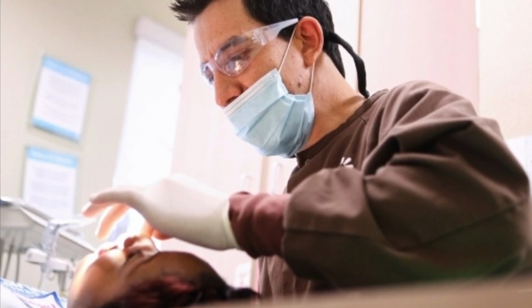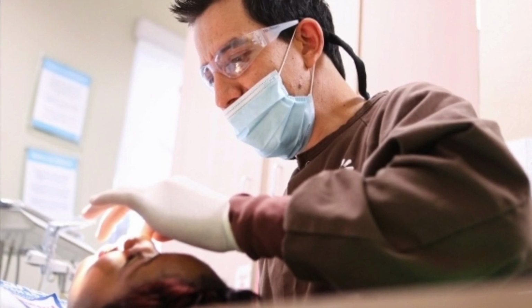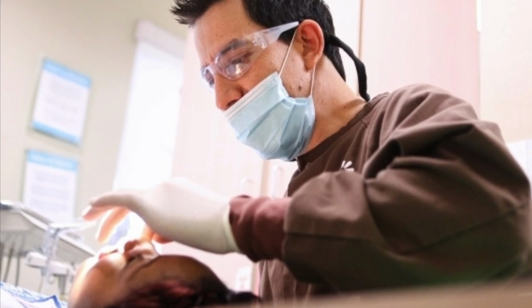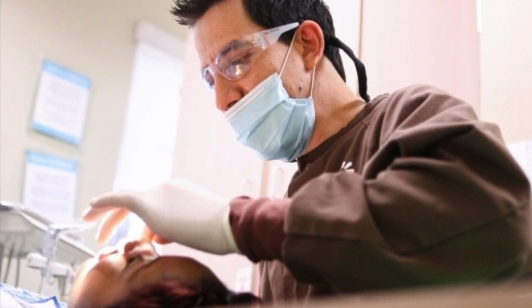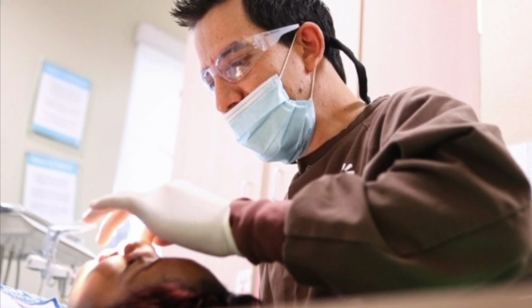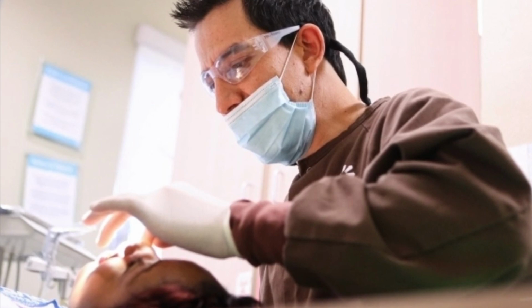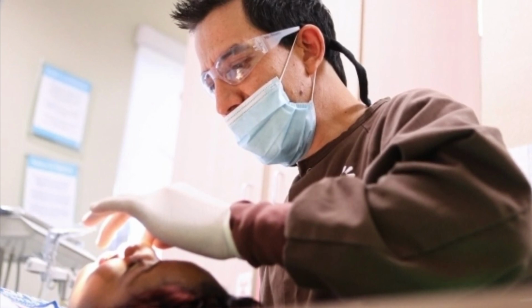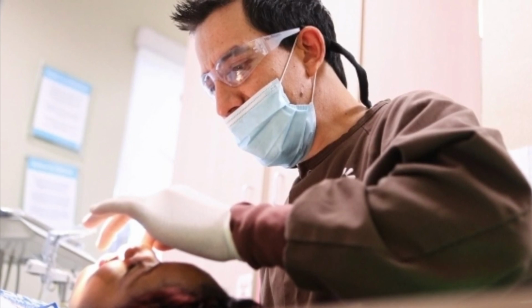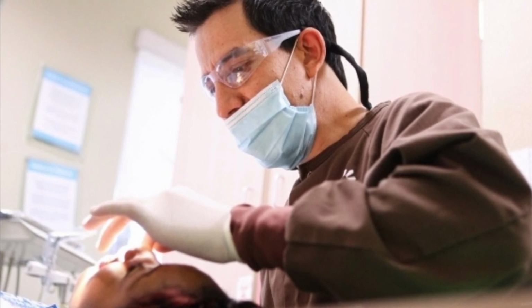Next, quarter-turn filing action. This action is a combination of reaming and filing action. The instrument is inserted in the root with a quarter turn, rotating 90 degrees. This one is only 90 degrees, that means only a quarter, not a full rotation, then removed with a dragging motion to produce an oval cross section. K-files and reamers are to be used.